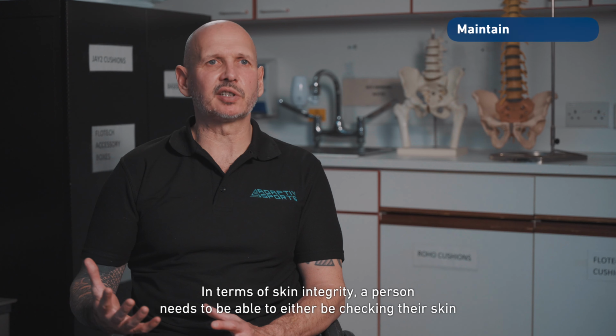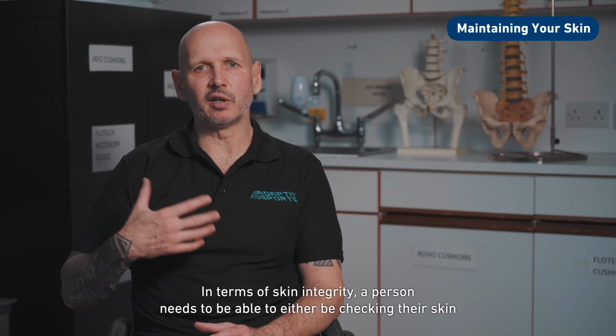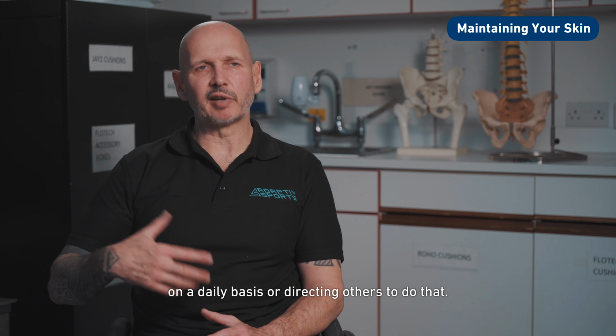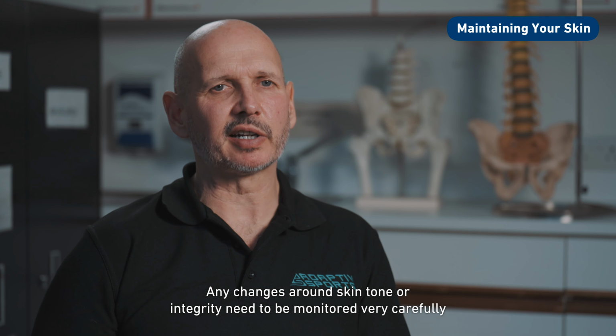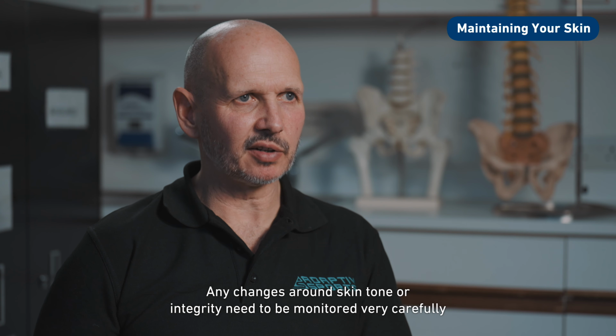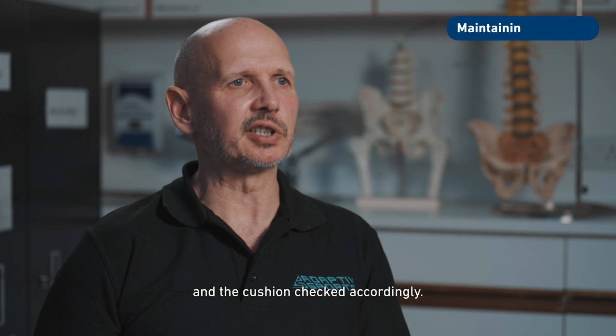In terms of skin integrity, a person needs to be able to either be checking their skin on a daily basis or directing others to do that. And any changes around skin tone or integrity need to be monitored very carefully and the cushion checked accordingly.